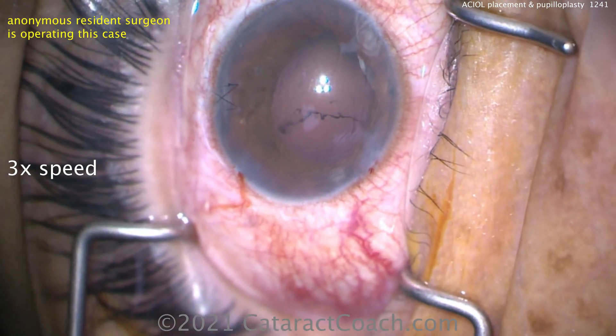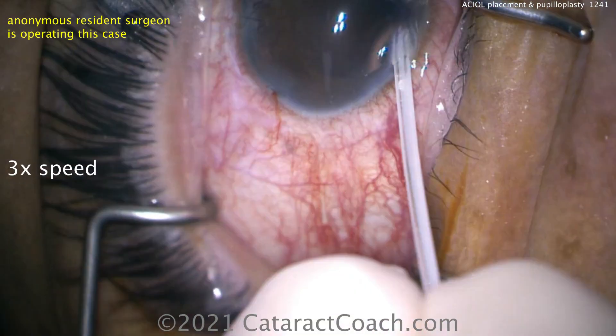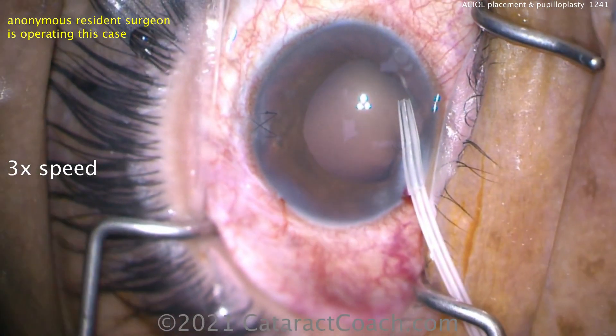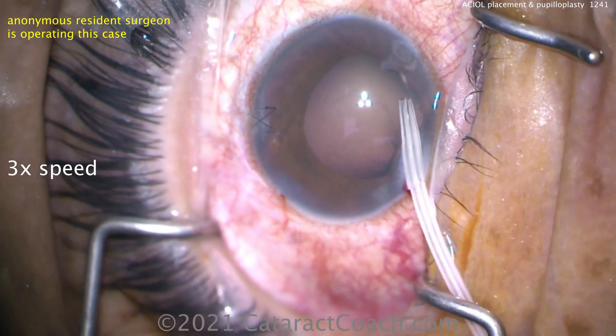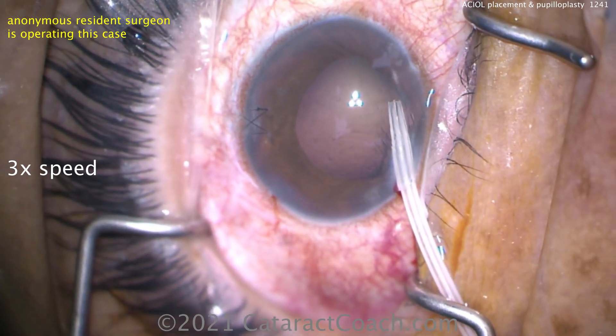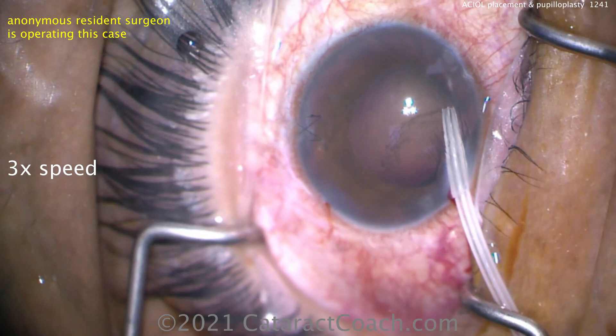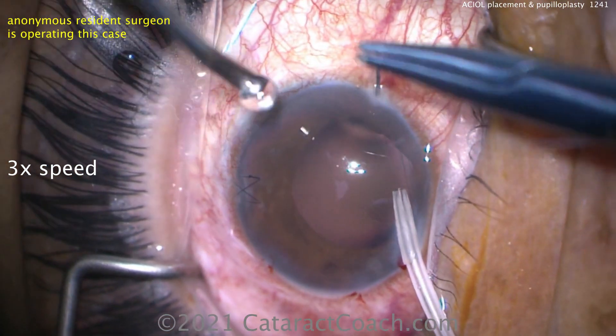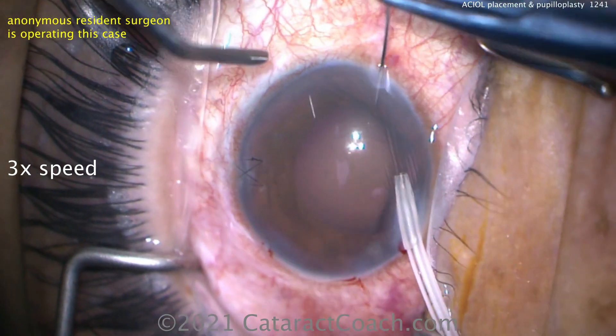Now we're making a decision here for an anterior chamber maintainer. We don't have a dedicated one, so we used a 23-gauge IV cannula — the plastic part of a sterile IV cannula normally used for intravenous administration of medicine. Now here comes the 10-0 proline on the very long needle.